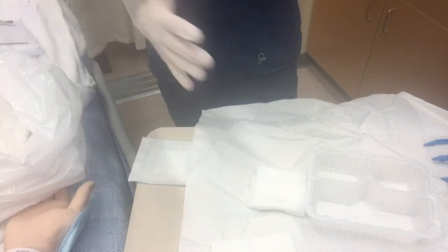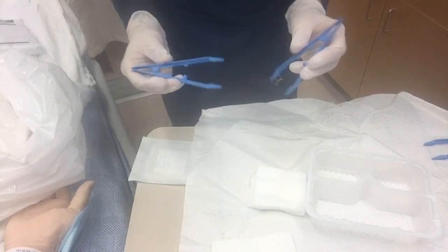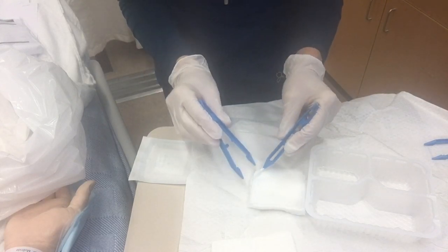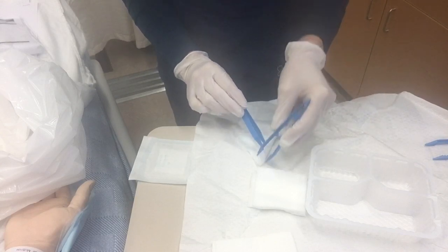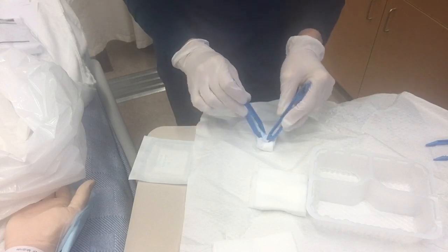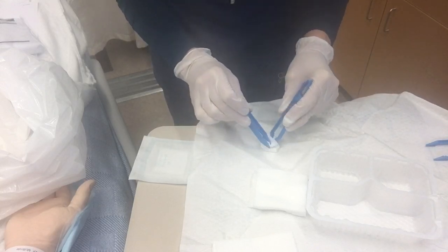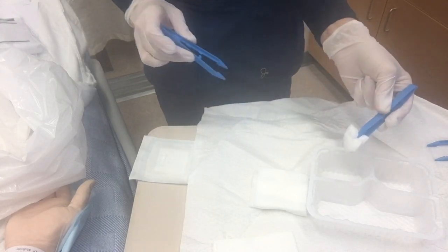Okay, with my two clean forceps, I'm going to take one gauze at a time, and I'm going to just package them up into little bundles. And I'm going to soak that in the normal saline.